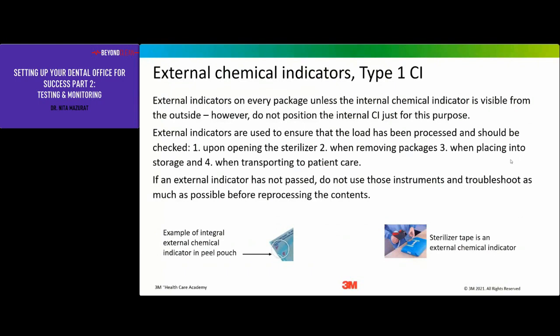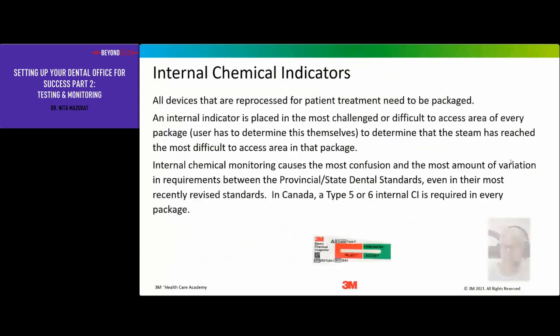Get yourself into the habit of checking all those 4 times. If an external indicator has not passed, please don't use those. It's not a question of please. Do not use those instruments. Troubleshoot to determine what's happening.